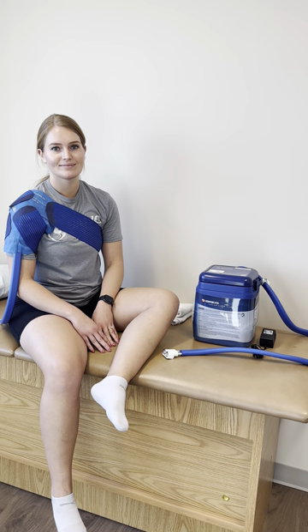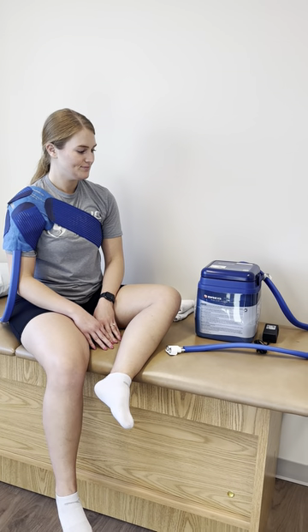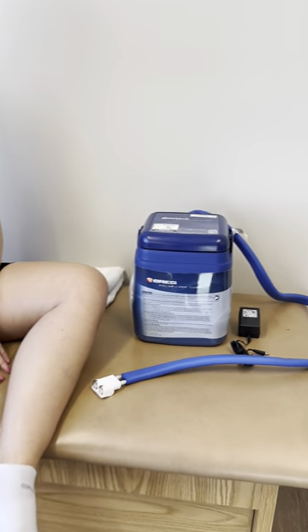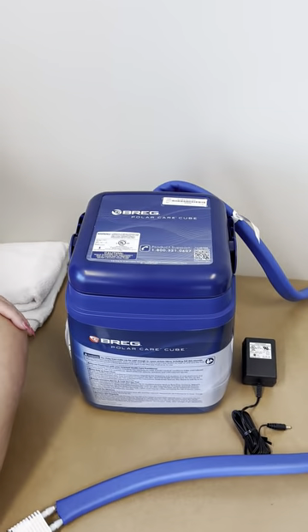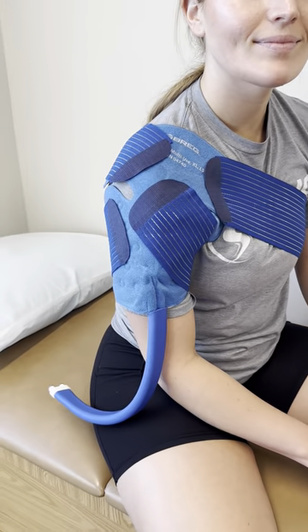This is the Polar Ice Care unit. This can be used to help with post-operative pain control. In the box, you will get a Polar Care ice chest, a plug-in, and a universal cooling pad.